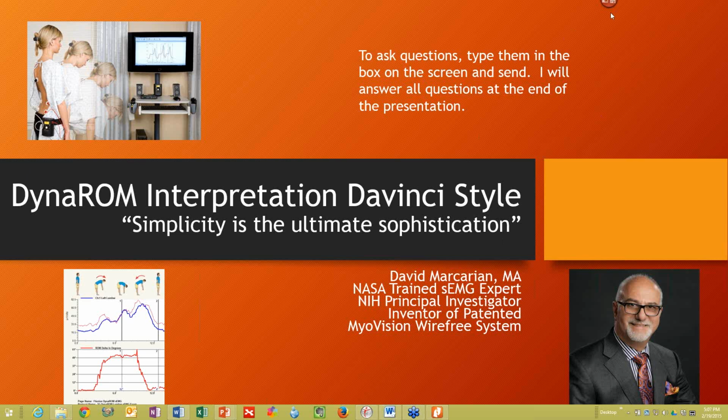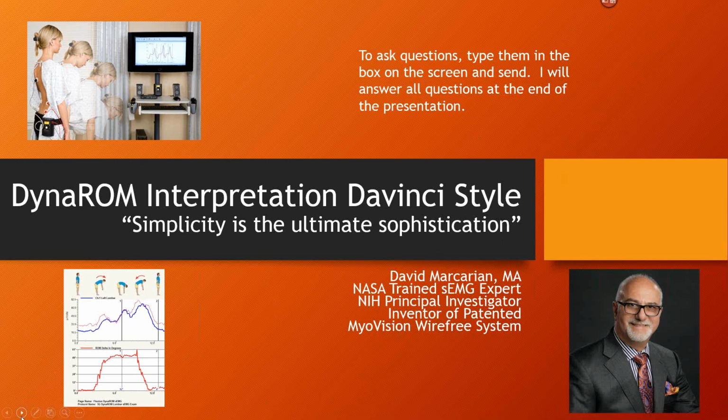with complex ways of looking at the data. I found out that there are some really simple ways of looking at these patterns that exist. And I've simplified all this to make it easy for you, and also made some major changes in the software to make it very easy for you to perform these tests and understand them.